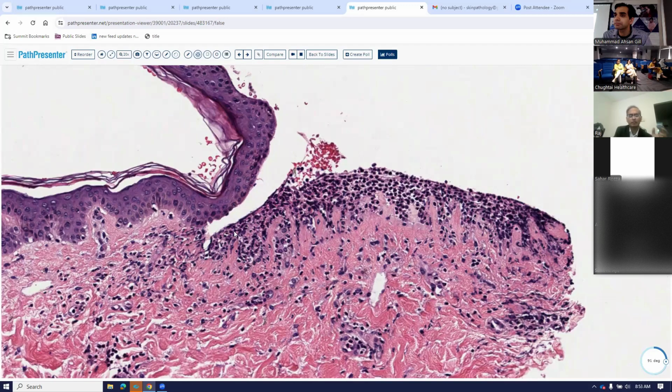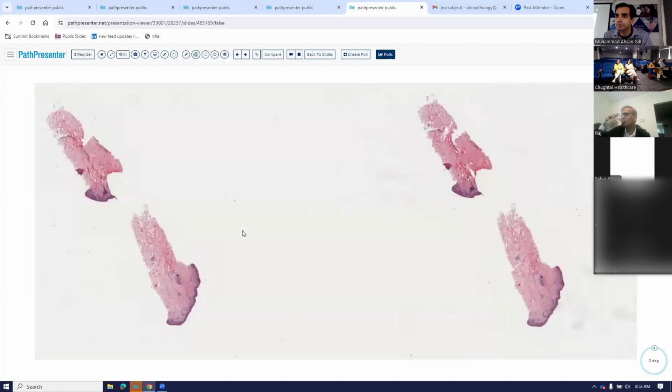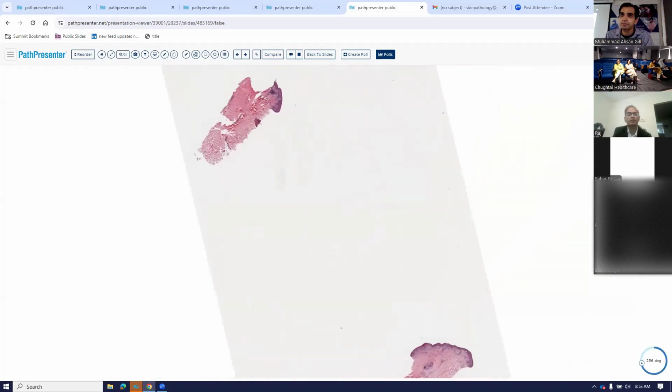And the other differential diagnosis is bullous lupus. So those are the two diseases, bullous lupus, which is very uncommon, and the more common one is the linear IgA vesiculobullous disorder, which is going to show you a subepidermal bulla with a ton of neutrophils associated in the dermis. Moving on to the next one. So let's make this straight here.